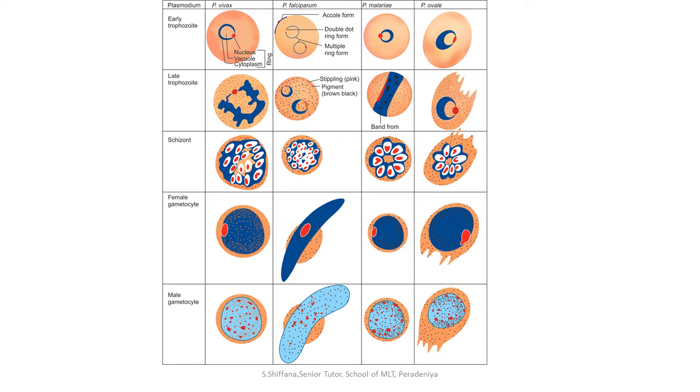When we consider the male gametocyte, the red cell morphology is also an enlarged RBC, pale color. The gametocyte is also round in shape. The cytoplasm color is bluish pink color. The nuclear color is pinkish blue. This is diffuse because the chromatin is diffuse. That's why it gets a light color compared with the female one. That's all about these two.